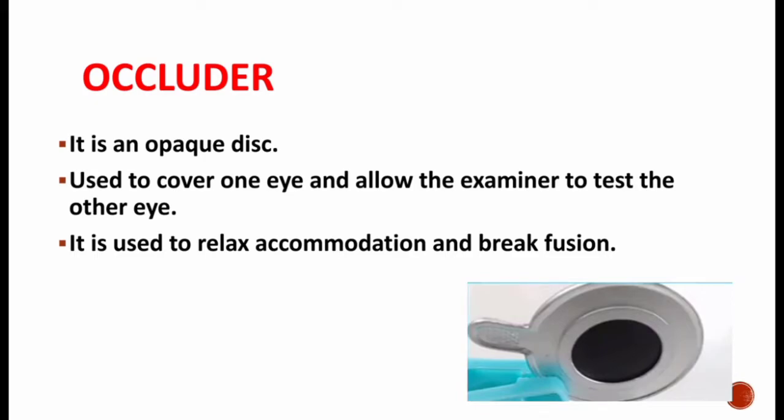Hello friends, in this video we are going to see about occluder, plano lens, red and green filter, and the stenopic slit. First we are going to see about occluder.